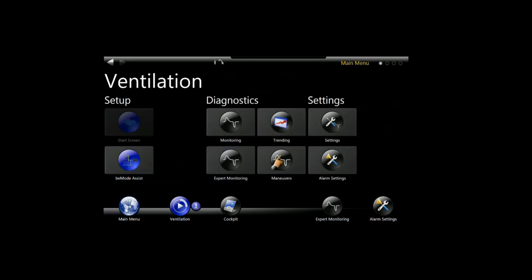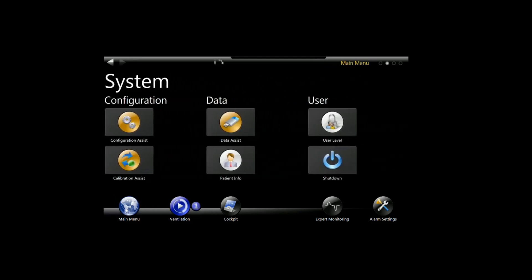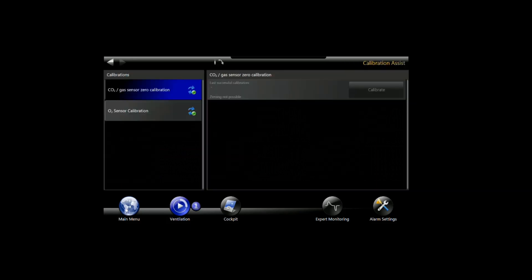We go to the main menu and we're going to scroll over to the calibration assist. This is where you can actually go to zero your sensor. As you can see right now, it says zeroing not possible because I haven't yet connected the sensor to the ventilator. I'm going to go ahead and do that and you'll see that this screen will update and change.